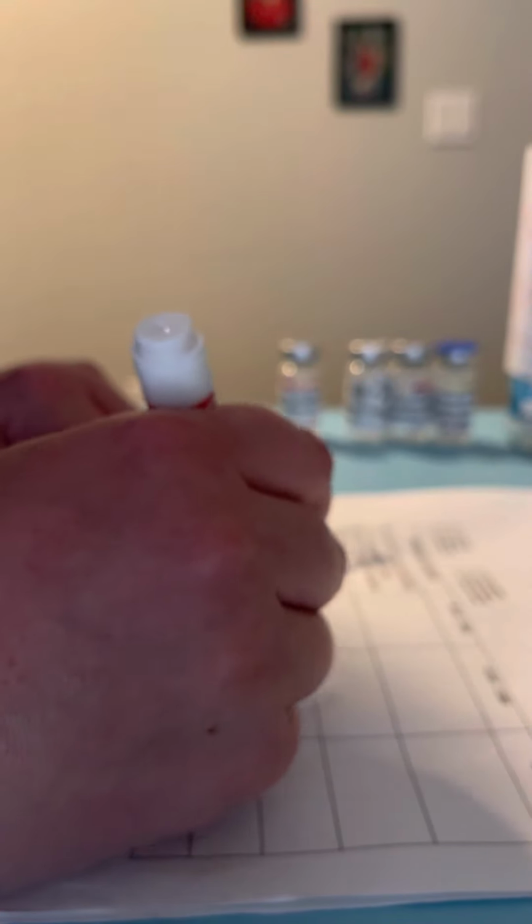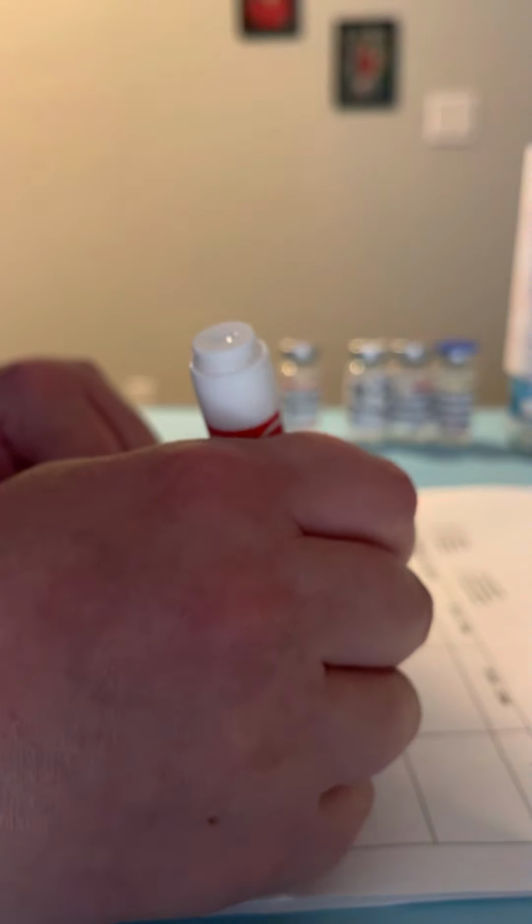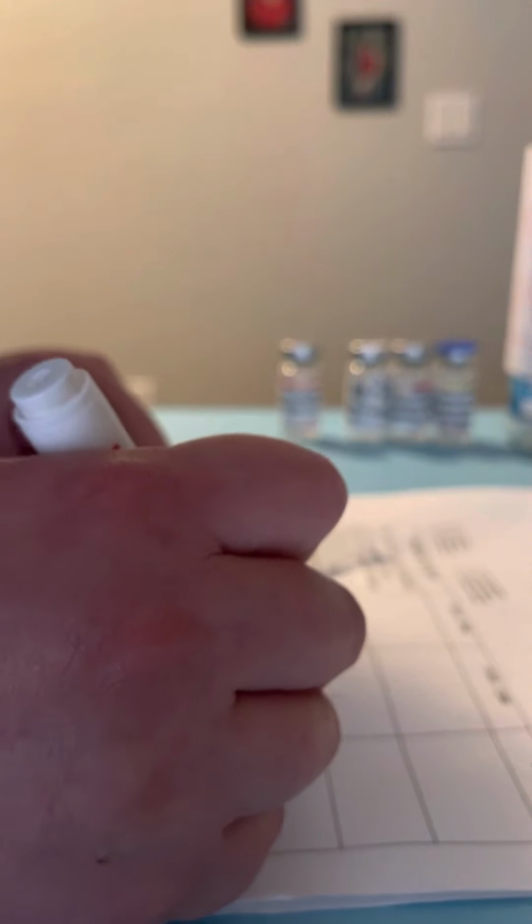On my label, I'm going to write my patient's name, Jaguar J. Jones, and 0.5 milliliters of heparin, or 5,000 units. I would have a nurse also come up behind me and check my calculation, make sure it's correct. And then I'm going to check.